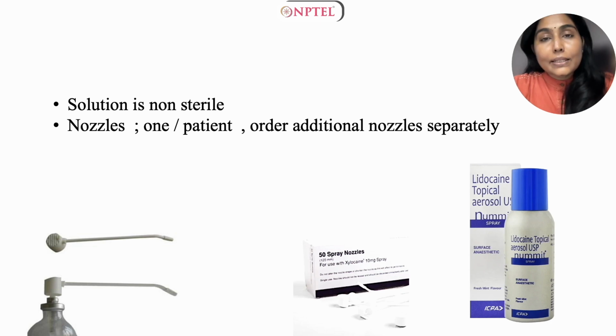The next concern is about sterilization. After the first use, the solution is non-sterile. Also, regarding the nozzles, while using, they get in close contact with the patient. Hence, one nozzle a patient is recommended. You could order the nozzles separately.